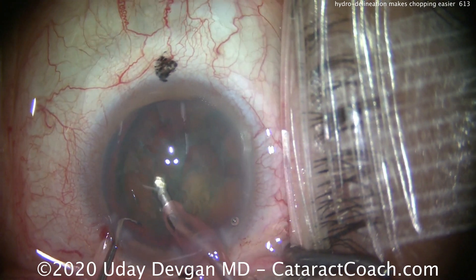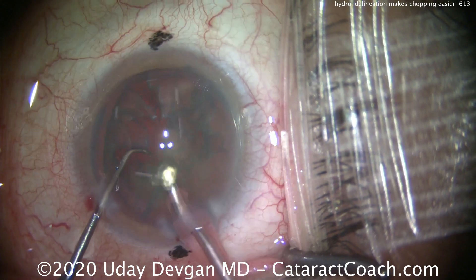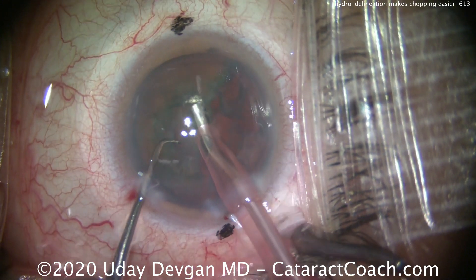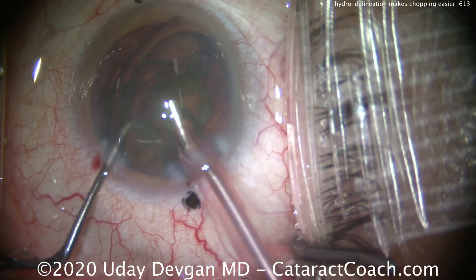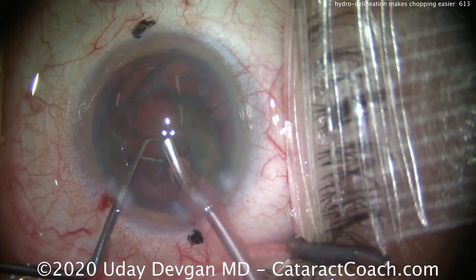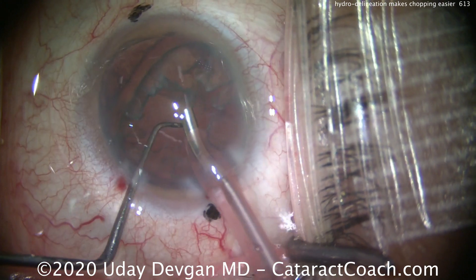Also, the hydrodelineation creates an epinuclear shell, which can serve to protect the posterior capsule and prevent it from coming up. So here we're very easily chopping this endonucleus — it's a lot smaller than the entire nucleus, and we can remove it with good speed and efficiency and a wide margin of safety.